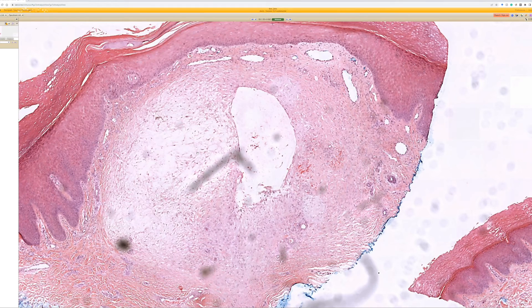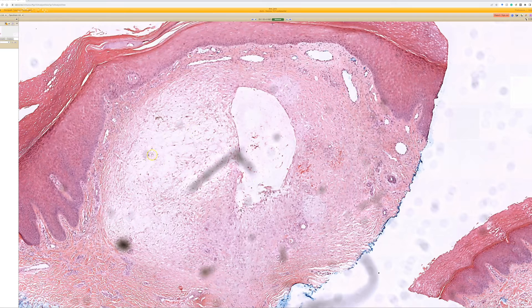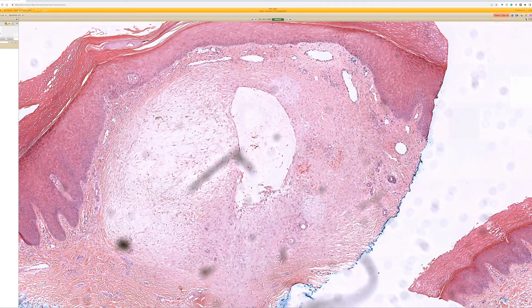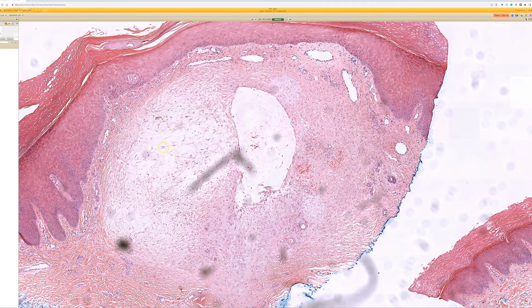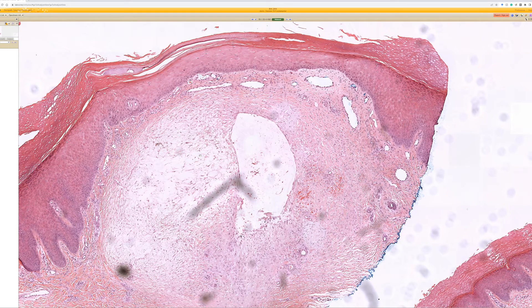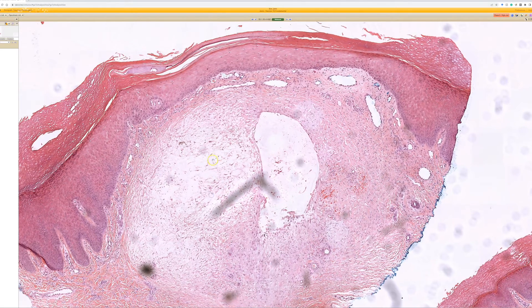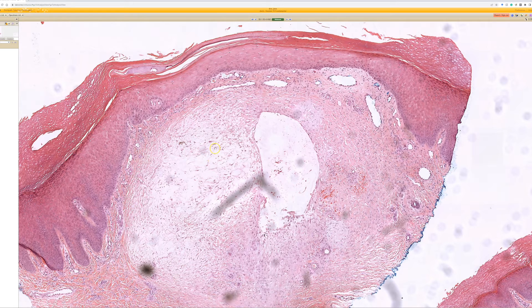It's cystic right here. And then here, not really. Here it's very loose and pale and has some scattered spindle cells floating around in it. So what's going on here? This cleared area looks like a lot of loosening. The little spindle cells can be hard to see from here, but I'm betting they're going to produce this mucin. And so this is a digital mucoid cyst.